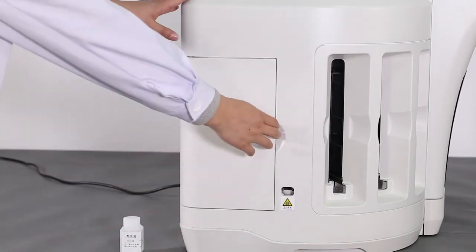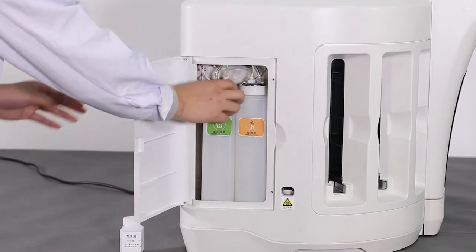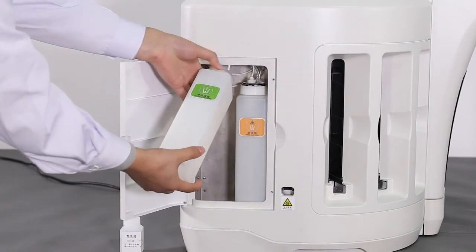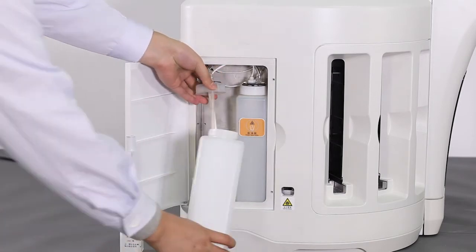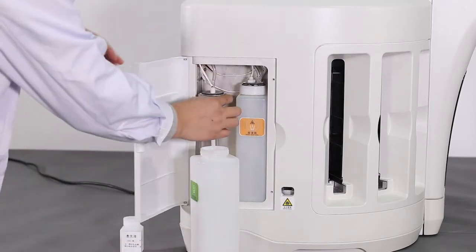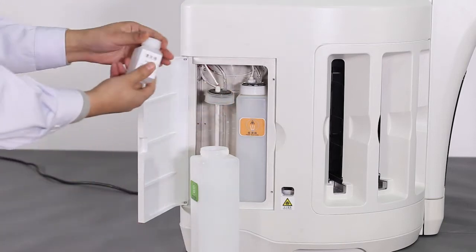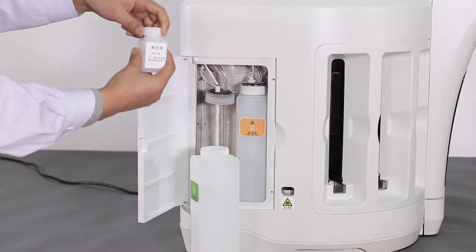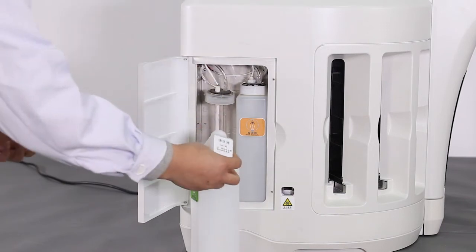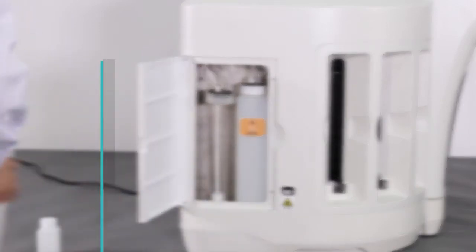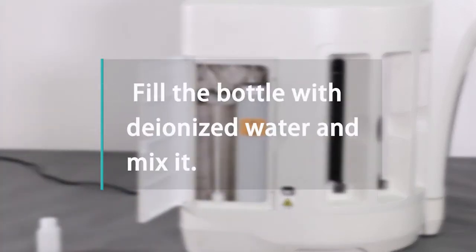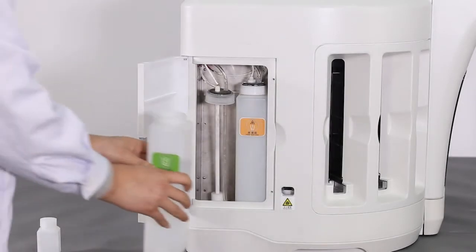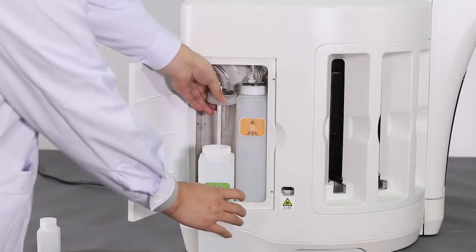To dispense cleaning liquid, you need to take out the cleaning liquid bottle from the storage zone and pour the cleaning solution in it. Then fill the bottle with deionized water and mix it. Finally, put the bottle back into the storage zone.